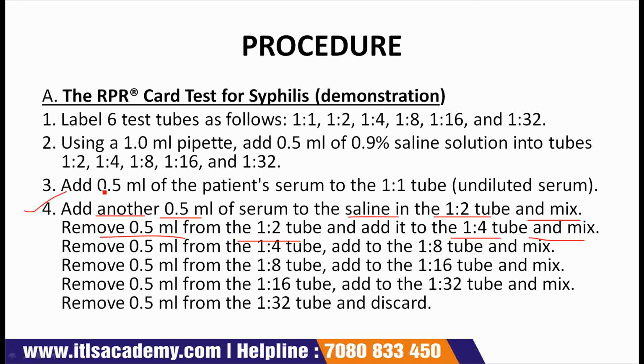Now again remove 0.5 ml from the 1:4 tube and add to the 1:8 tube and mix. This process will be repeated till the last tube.